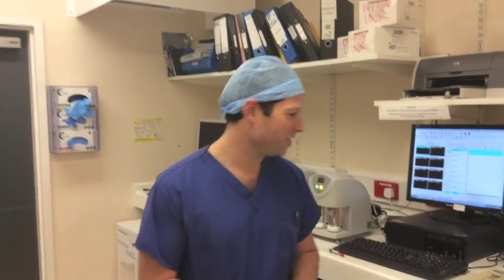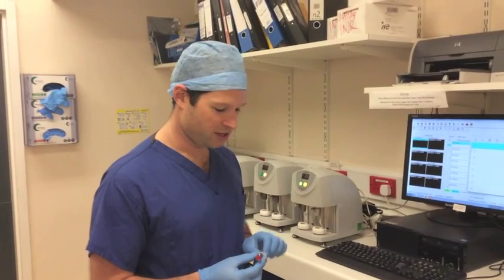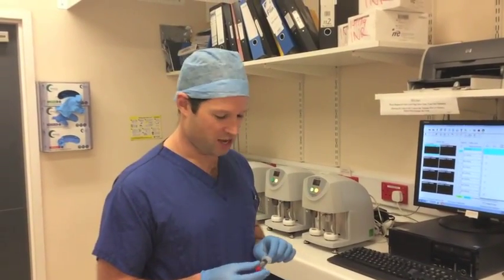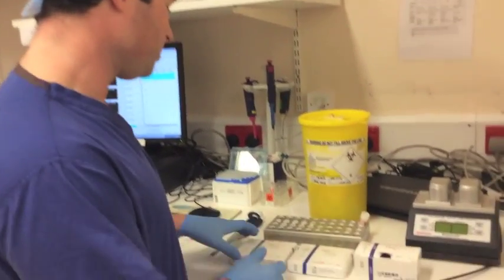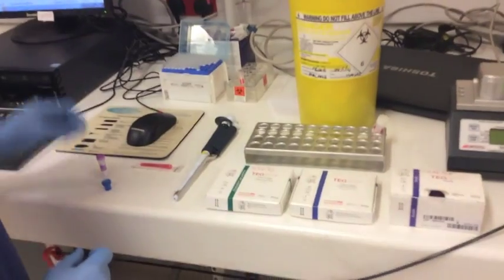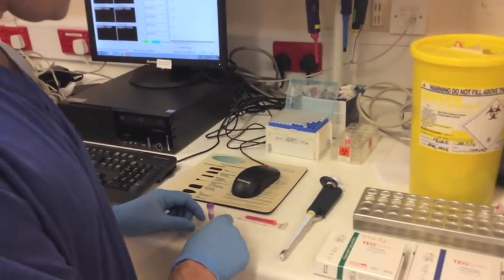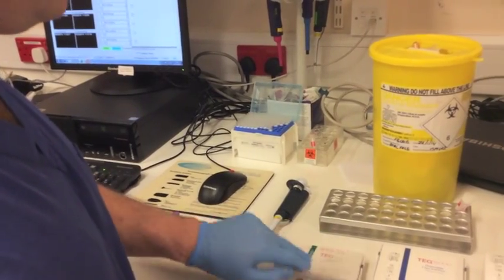First we're going to show you the equipment that we need. You will need a sample of blood from your patient in a 5ml syringe — taking 3 or 4ml will be absolutely adequate. We'll use saline for this demonstration. You then need your cups: you have both clear and heparinase cups. The clear cups are clear as shown, and the heparinase cups are blue as shown, so you need one of each of those.